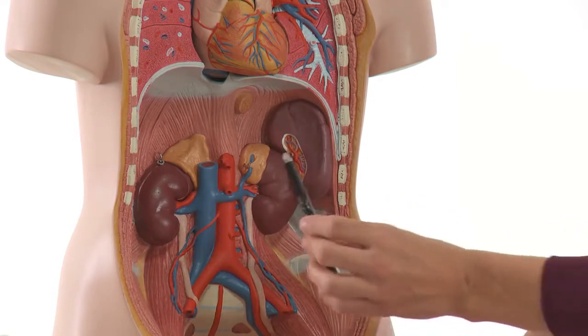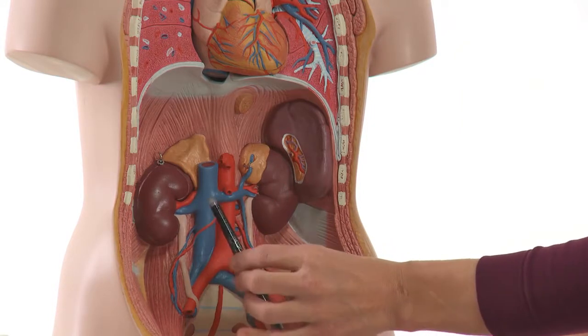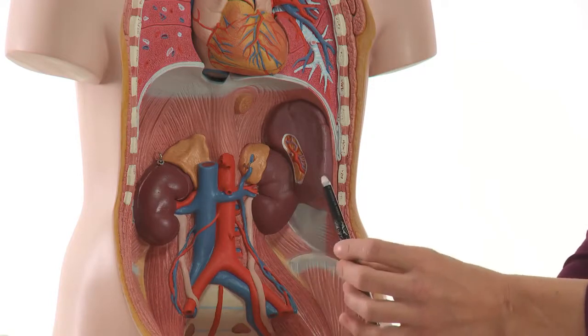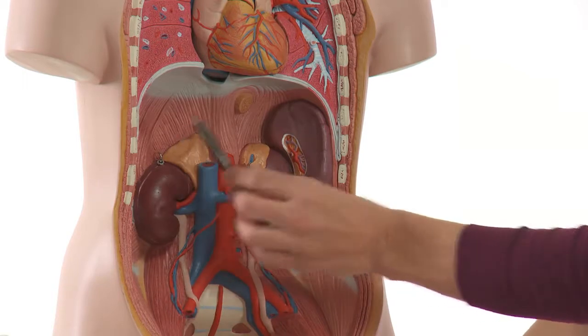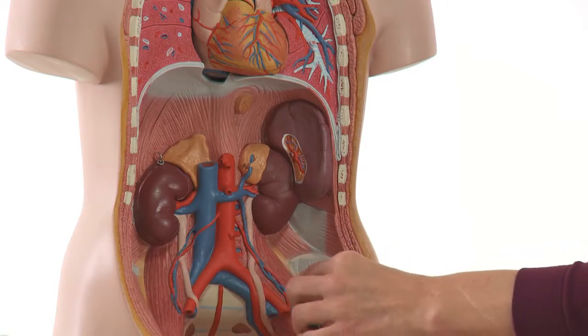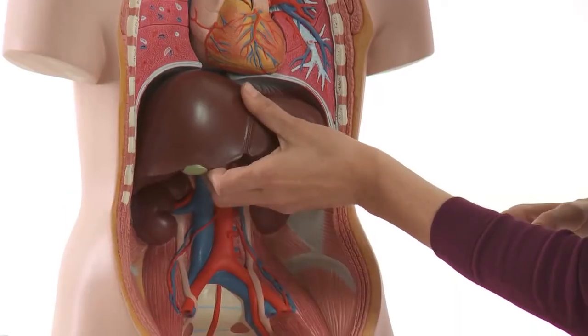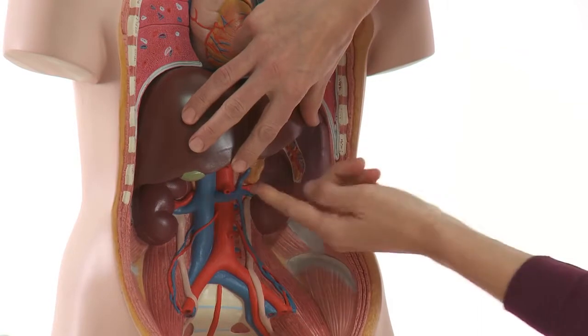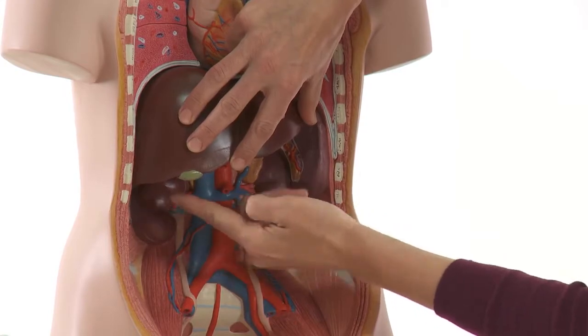And we can easily see that the aorta is near the left kidney, the IVC near the right kidney. And these two caps over here are the left adrenal gland and the right adrenal gland. And we can also see the psoas muscle here on both sides, where the kidneys slide up and down with a breathing movement. Another neighboring organ is the liver with the gallbladder. We can see in the normal position, the liver is near the right kidney, and also the gallbladder is an adjacent structure.